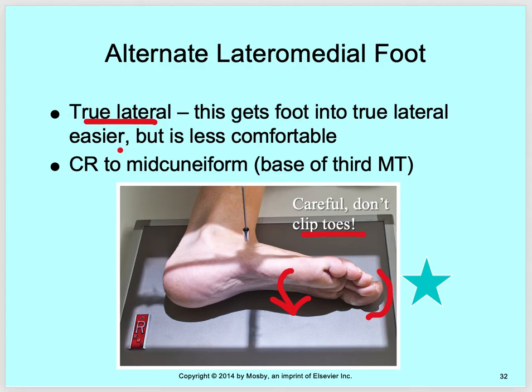The lateral medial gets the foot into a true lateral easier, but is less comfortable. So it gets it into a true lateral, but it's harder for a patient to do it. That's why we do the medial lateral. So still to the mid cuneiform and the base of the third MT joint.